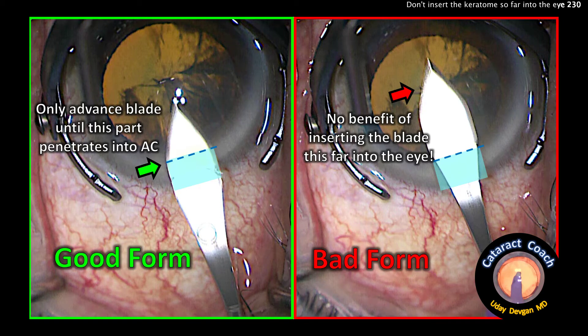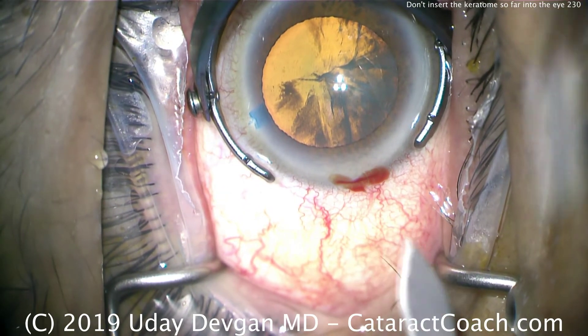CataractCoach.com. Look at the left picture — that's correct. Now look at the right. You should not insert the blade this far into the eye. Let me show you first the bad form.